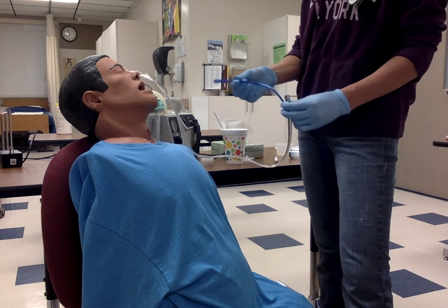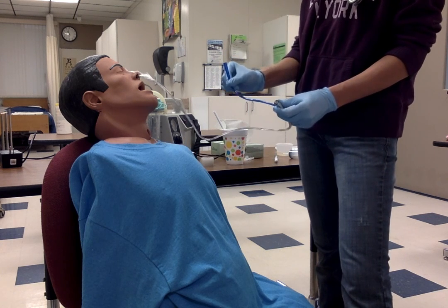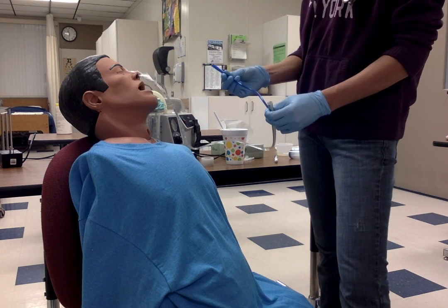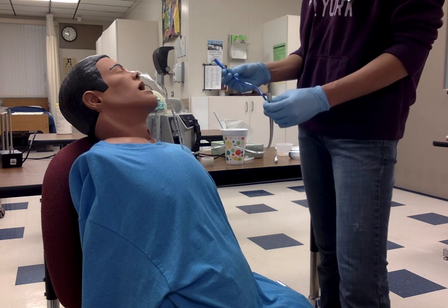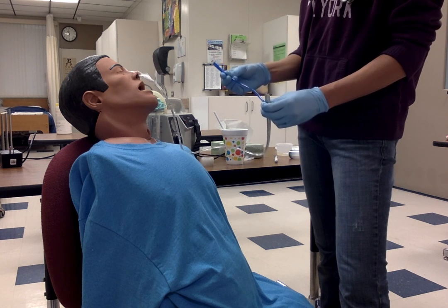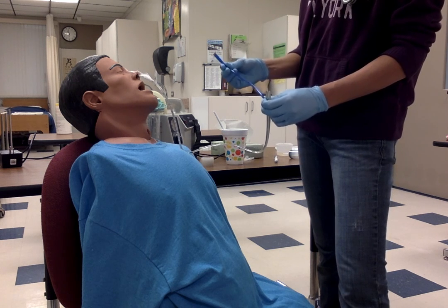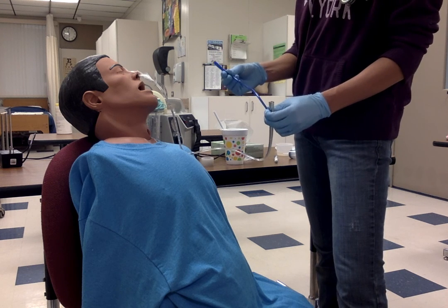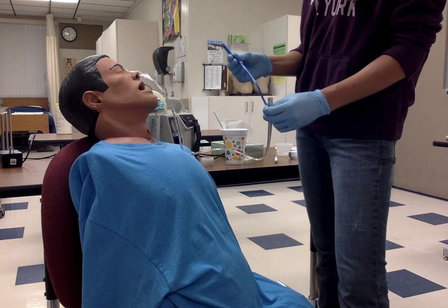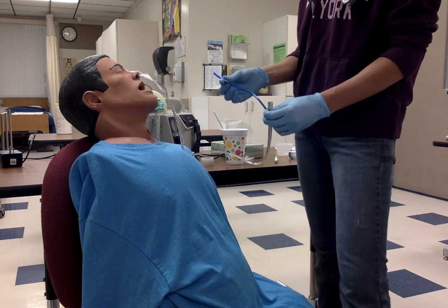So another thing I want to note here is the blue tube here. This is an air vent. This is to be used only for air if it's needed. Otherwise, you would never suck anything out of here. You would never push any meds through here, never hook up a tube feeding through here. So this is strictly an air vent.